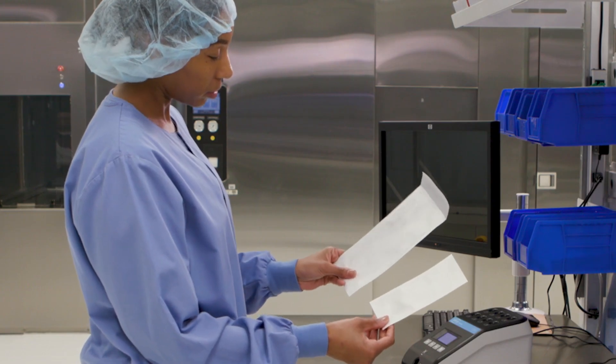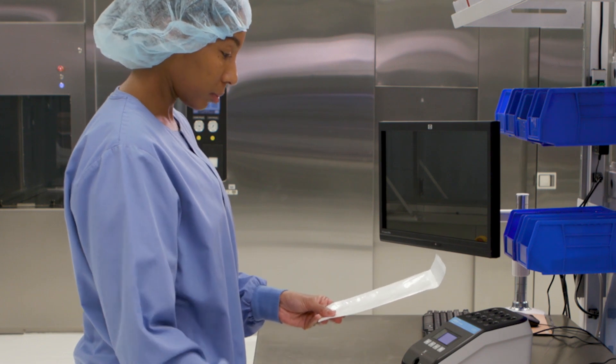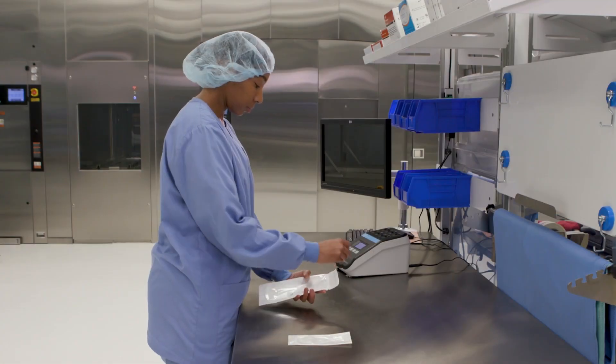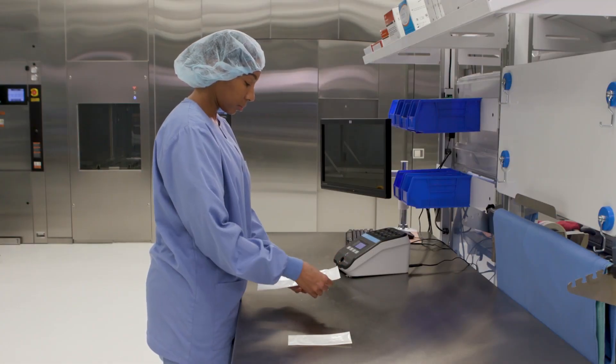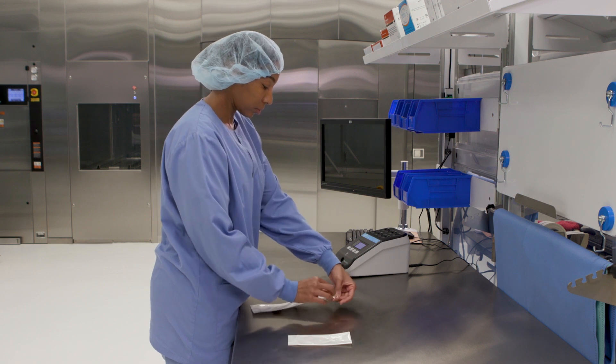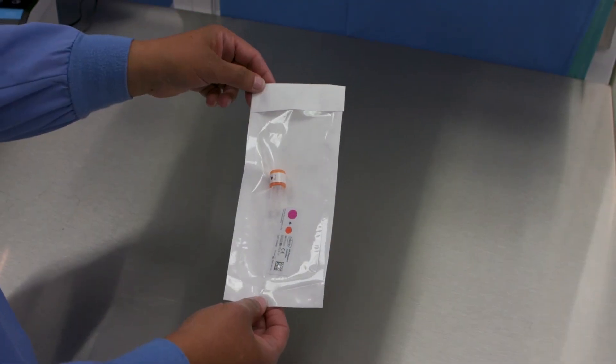To build the test pack, select an appropriately sized pouch. Insert one chemical indicator into the pouch, ensuring it is visible. Then place the BI inside and seal the pouch.